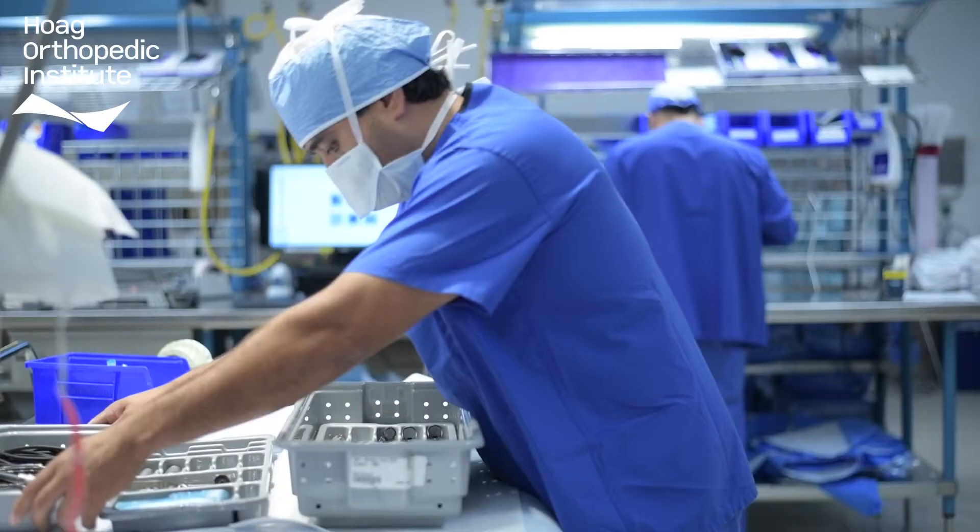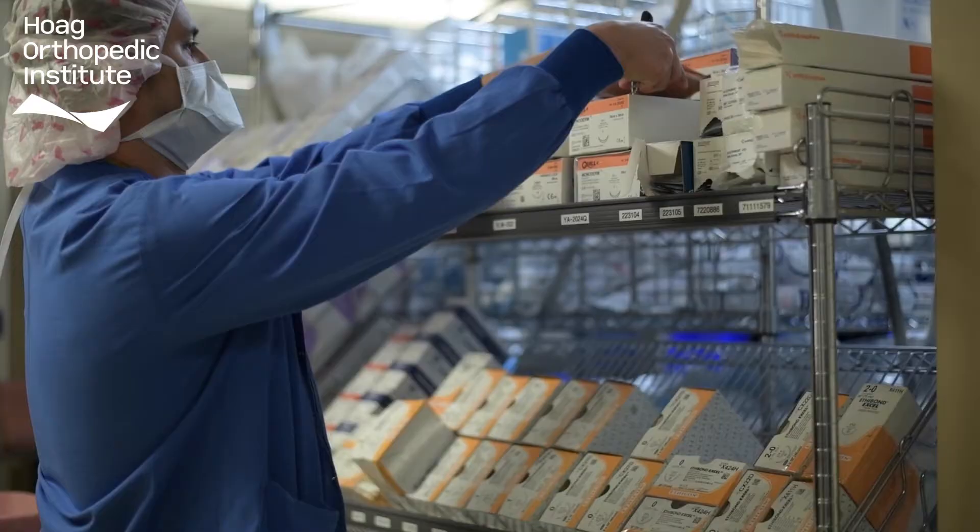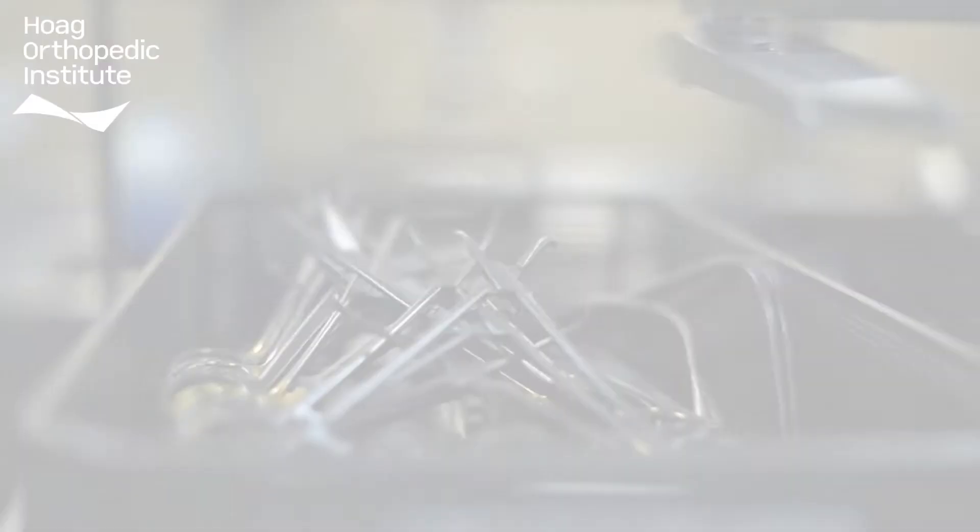It's here where our instruments are cleaned, inspected, assembled, and sterilized and prepared for surgery. Not too many people are familiar with this department, so I'd like everyone to have a chance to look and see what's going on inside.